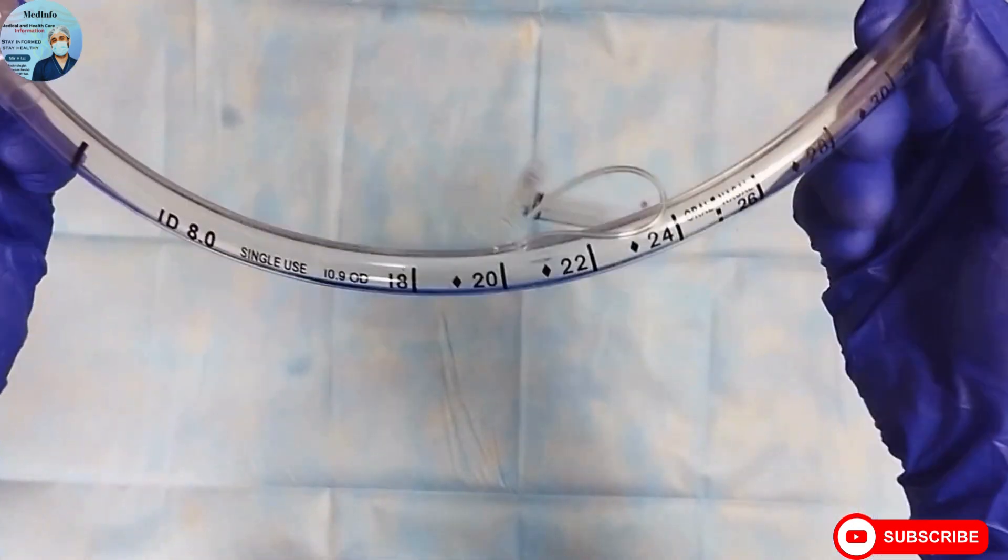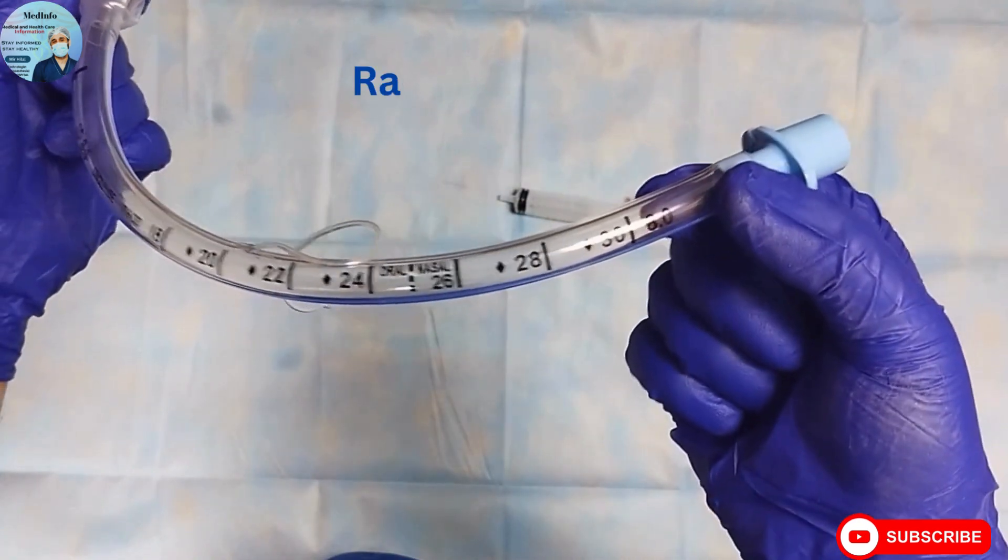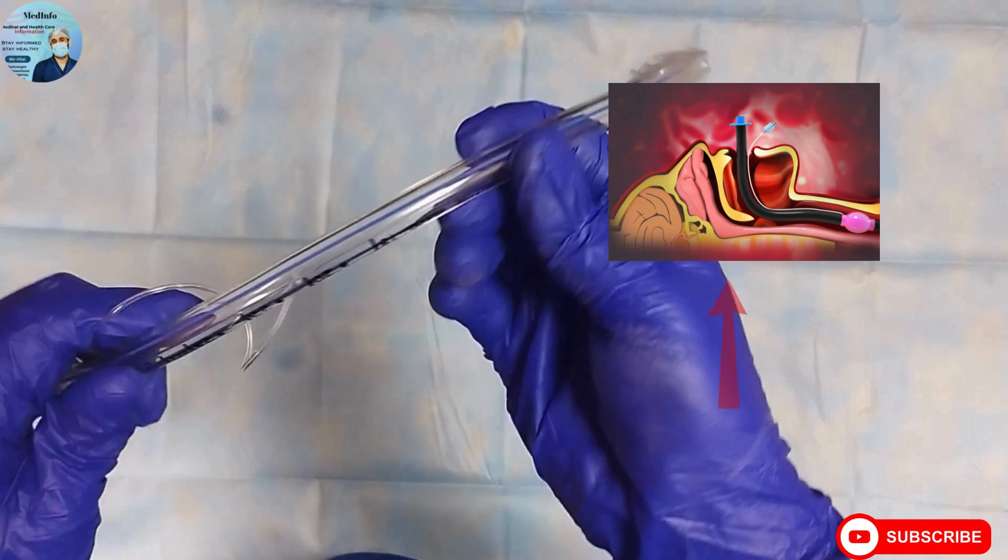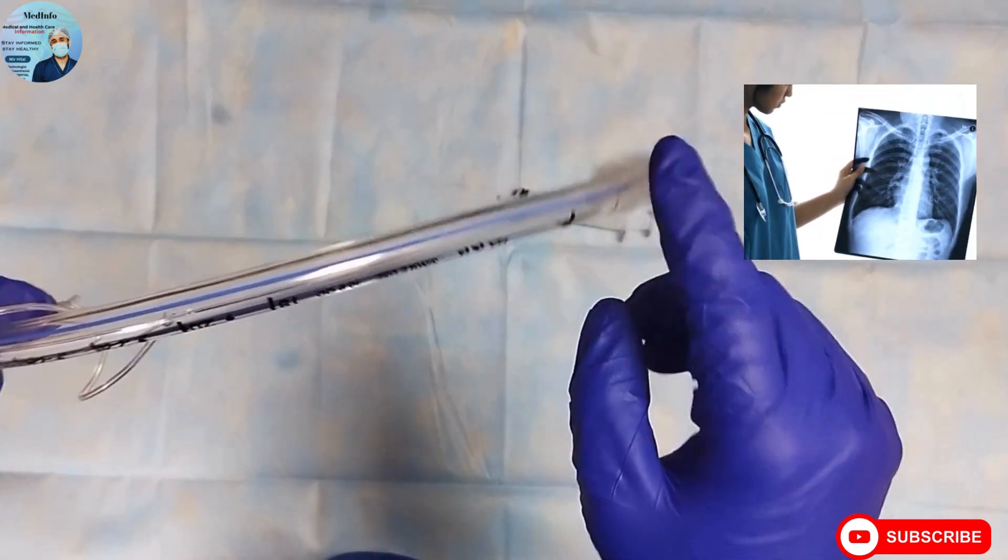Therefore, the secretions, clots, and mist can be easily visualized through it. Here you can see the radio opaque marker, which is used to check the position of endotracheal tube within the trachea after intubation by means of x-ray.